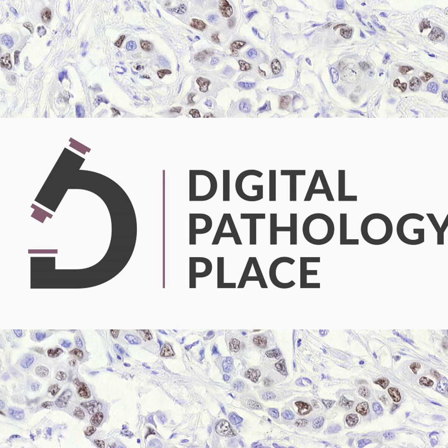So when we are assembling cohorts for AI training or validation, we would like to know what's inside these cohorts, right? What is the content of those whole slide images? So far it was like opening the image, checking what's there, and then somehow assigning it to your cohorts. There are no standards that currently exist for this metadata. Wishful thinking, right? We would like to have this information, what's in this tissue, in the metadata. Sometimes we have it, most of the time we don't, so we rely on manual inspection, which is not suitable for large collections with millions of objects.